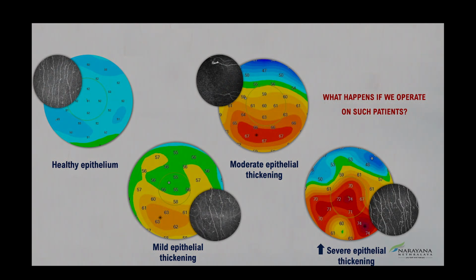Now, why so much about epithelium? Because as I mentioned, this was my first slide. If there is an irregular epithelium, that means your corneal nerves are unhealthy. It's not just your ocular surface issue, but underlying your corneal nerves are unhealthy, and you can have something like a dendritic cell, or absence of nerves, or a microneuroma, or you can have multiple mature dendritic cells.